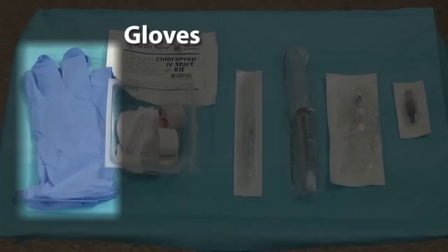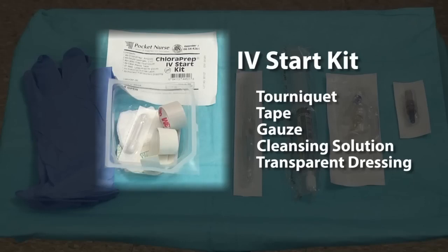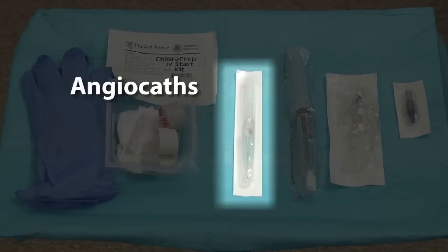Supplies to be gathered include non-sterile gloves, an IV start kit that consists of the tourniquet, tape, gauze, cleansing solution, and a transparent dressing. If your agency doesn't have packaged IV start kits, you will need to gather these separately. Appropriate sized and colored angiocaths. You may want to take 2 with you in case your first IV stick is not successful.